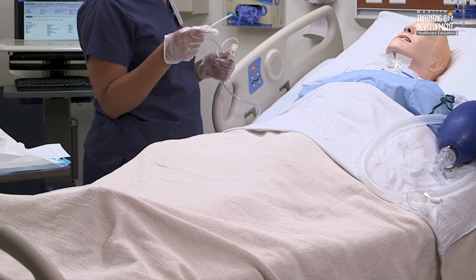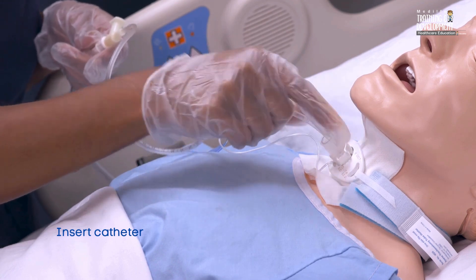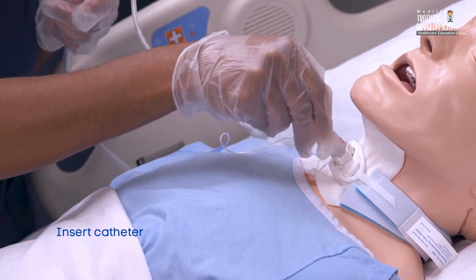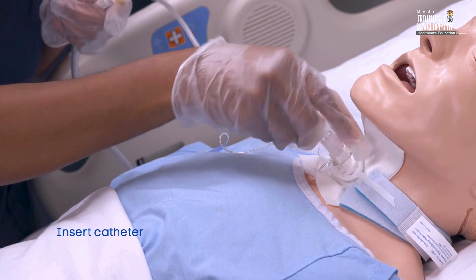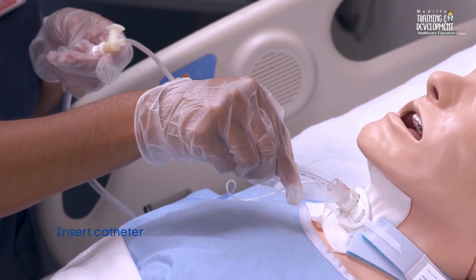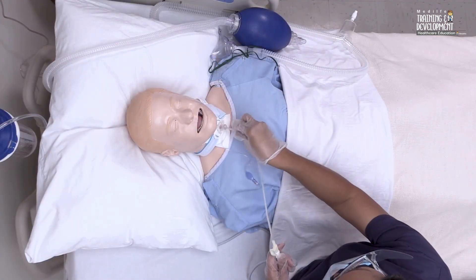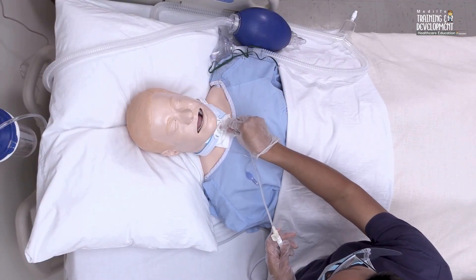Insert the suction catheter into the tracheostomy tube. Don't apply suction while inserting the catheter to prevent hypoxia. For deep suctioning, insert the suction catheter until you meet resistance and then withdraw the catheter 1 cm. For shallow suctioning, insert the catheter to a predetermined length, usually the length of the tracheostomy plus the adapter if present.